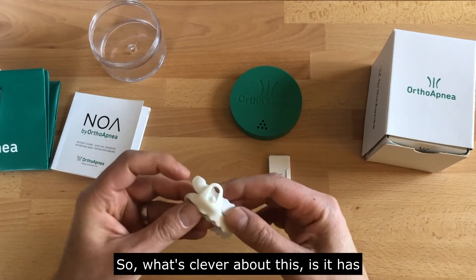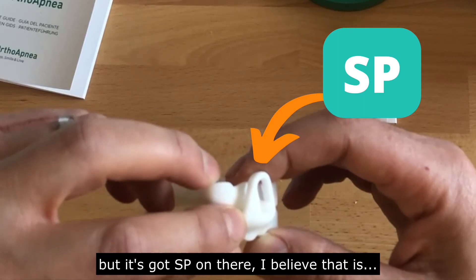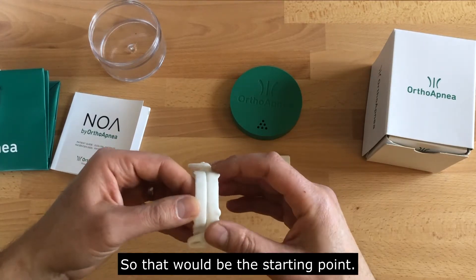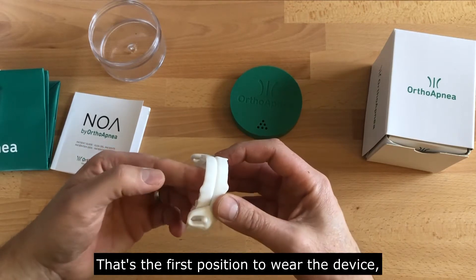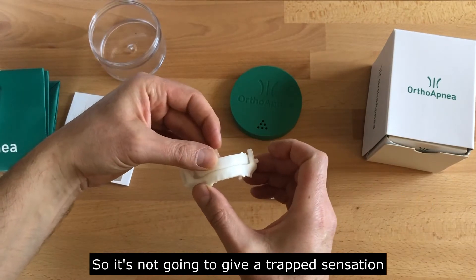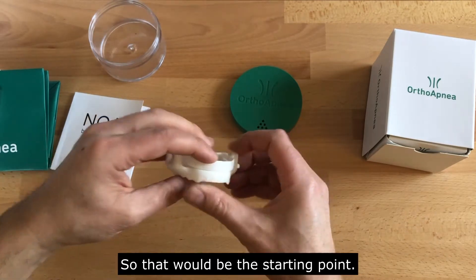What's clever about this is it has a CAM mechanism here. It's got 'SP' on there — sort of standard position, I would predict. So that would be the starting point: the first position to wear the device. You can see that the lower jaw can move with a little bit of opening. They're not locked in, so it's not going to give a trapped sensation and they can open and close.